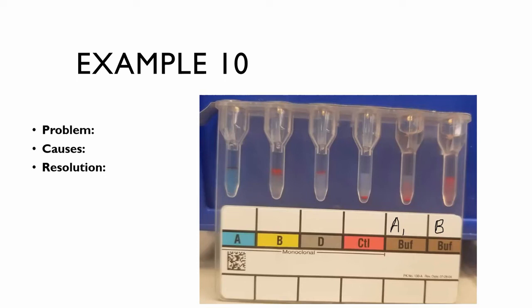They have some anti-A and anti-B in their system from that plasma that was transfused. Or this can also be caused by Rouleaux. Have you guys seen Rouleaux in your hematology courses?